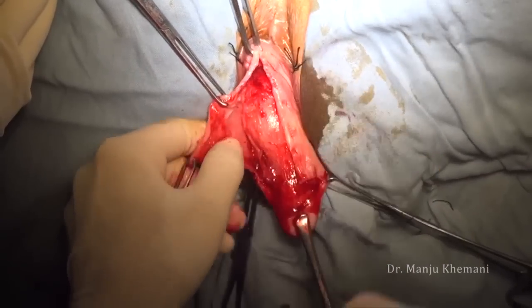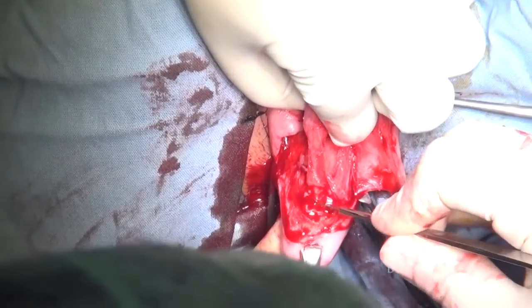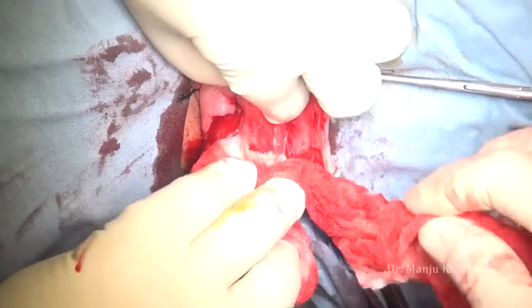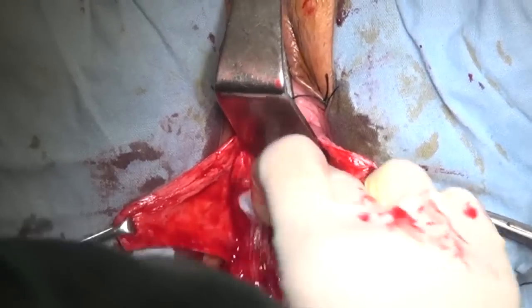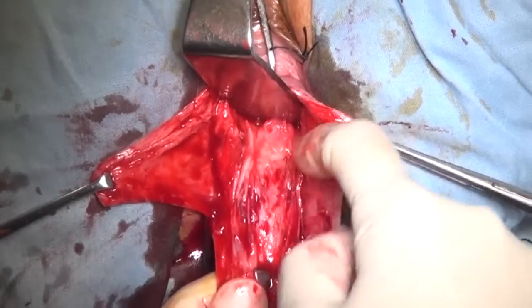The extent of the separation is up to the lower edge of the pubic rami. The same thing is done on the opposite side. Pull up the bladder and cut the attachment of the bladder to the cervix — it is pushed up.